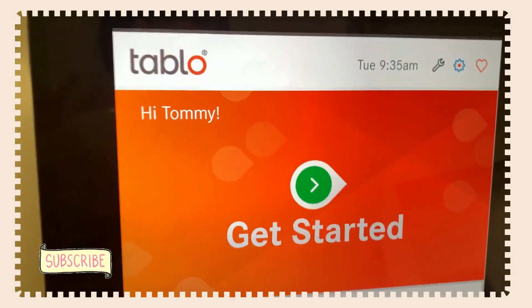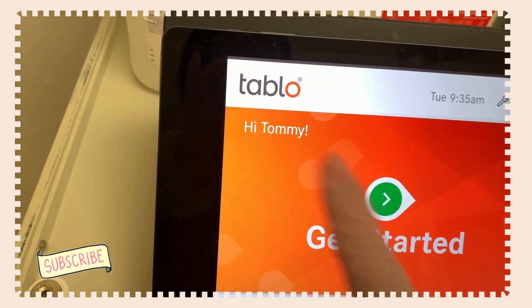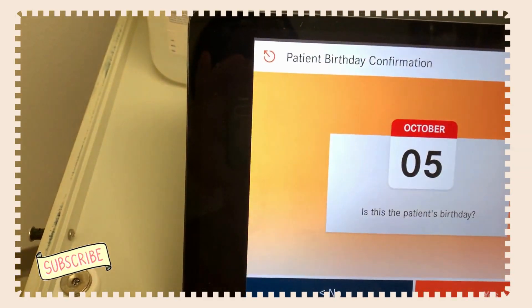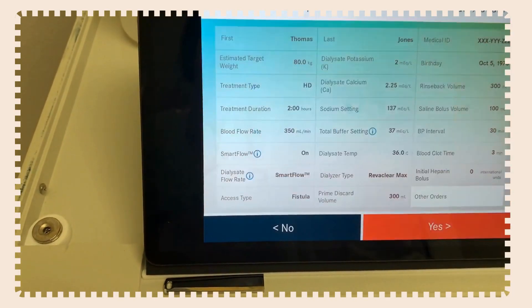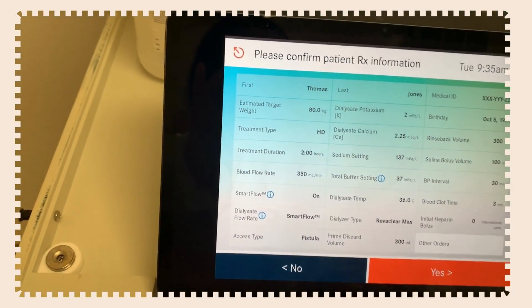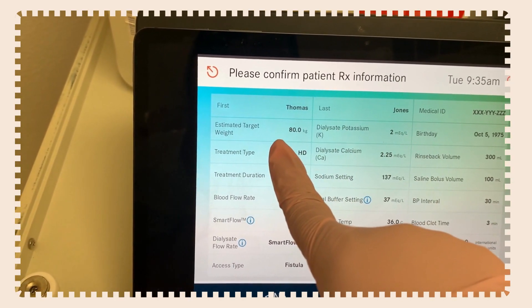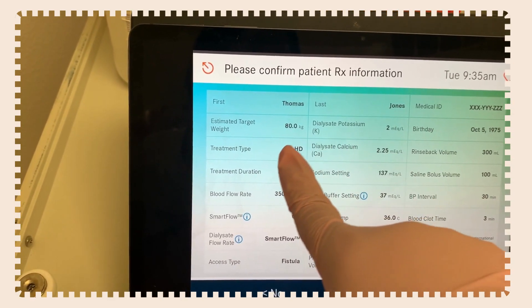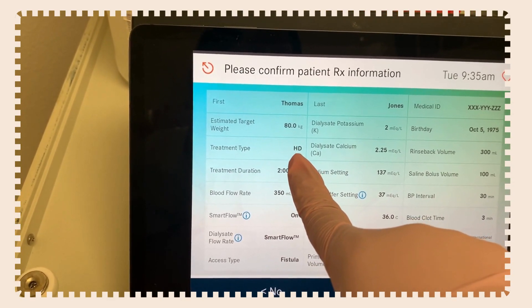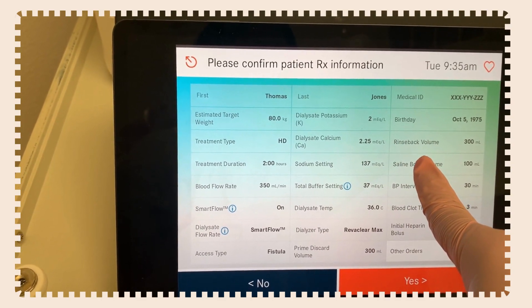This is a demo, so Tommy is not a real person. So if you have this machine at home as a patient, this is the first thing you'll see. You want to make sure that it has your name — first and last — your medical ID, your estimated target weight, potassium bath, your birthday, your treatment type which is HD (hemodialysis), and your calcium bath.